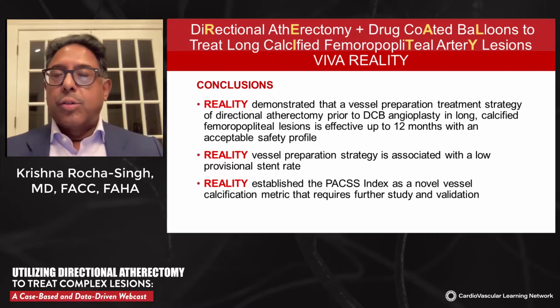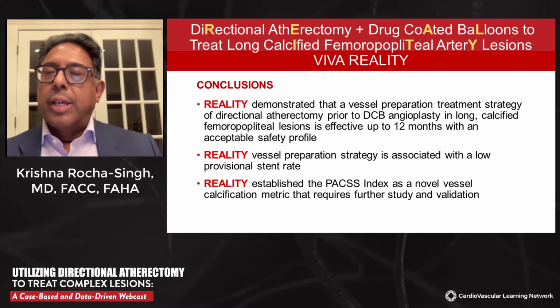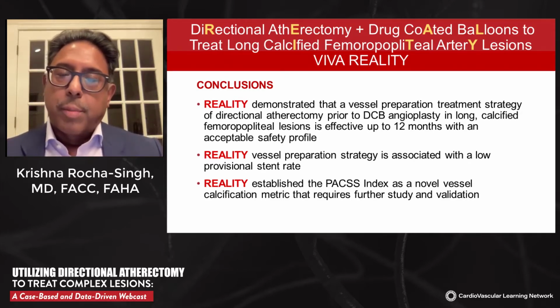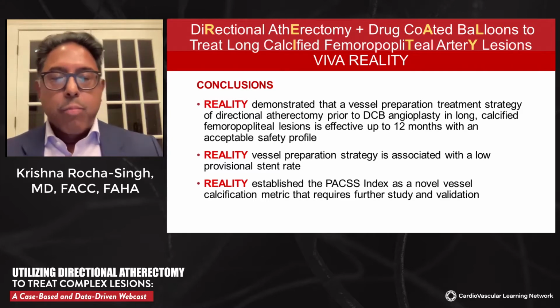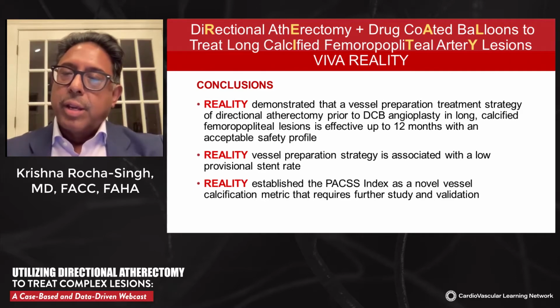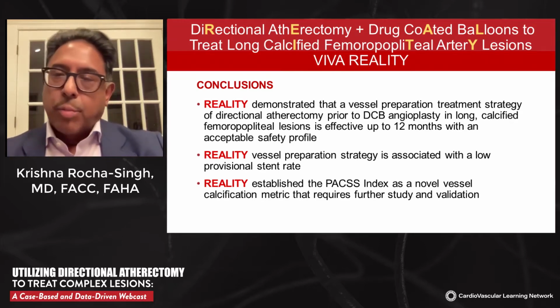Importantly, again, this shows that this application of this strategy resulted in a low provisional stent rate of less than 10%, which is a significant departure from other DCB trials as a standalone therapy in this complex population. And finally, the REALITY trial established the PACSS index as a novel assessment of the degree of calcification that needs further study and validation. Thank you very much.